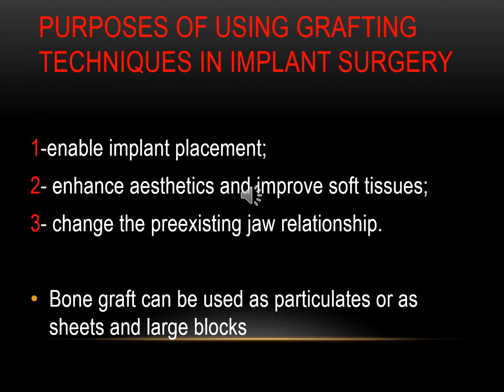If we plan to insert an implant, or even if there is no implant in our treatment plan, it's very important to graft the resorbed bone, because soft tissue always follows the bone, and grafting of the bone will enhance the aesthetics and improve the soft tissue.